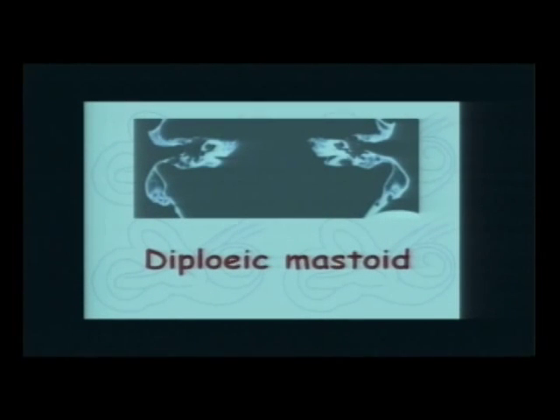A diploic mastoid is non-pneumatized. What's the importance of it? Oh, it's not a problem whatsoever, but you have to be careful. You see where the sigmoid sinus is? It's under the cortex of the mastoid immediately. So when you first put your drill here, you're going to see in front of you what? The sigmoid sinus.